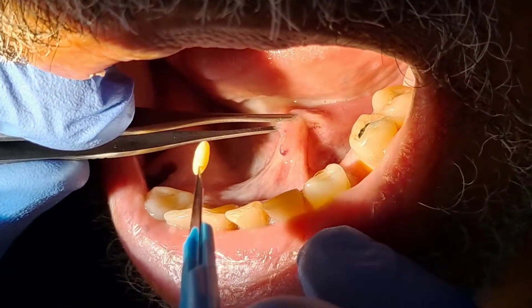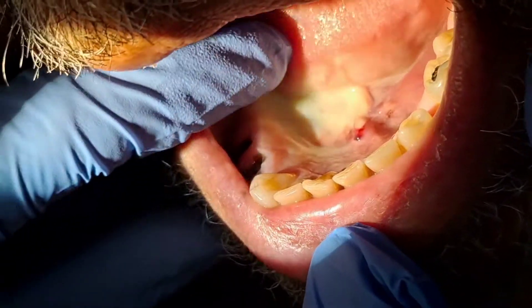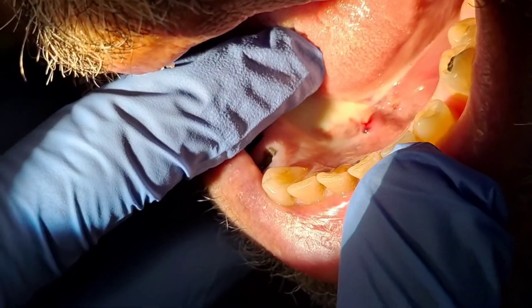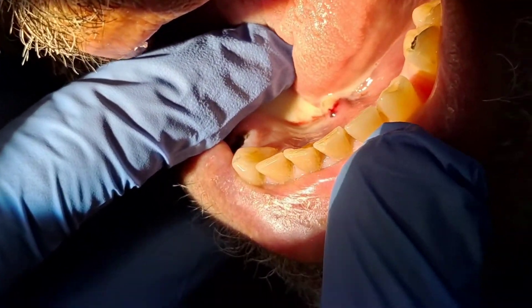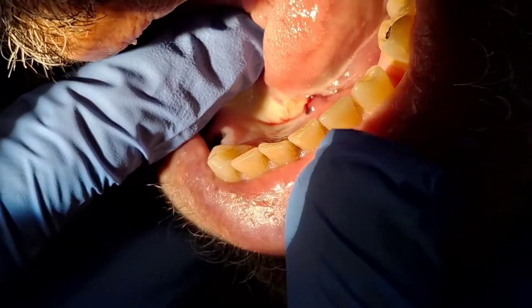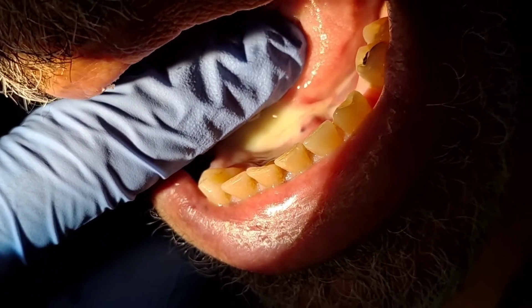That's the little stone. After that, we squeeze the sub-mandibular gland in order to extract all the pus that was stuck in there.